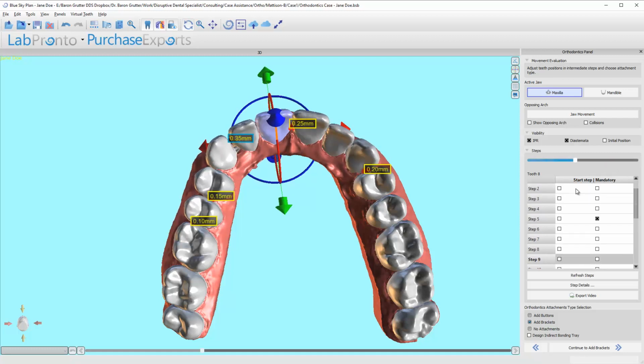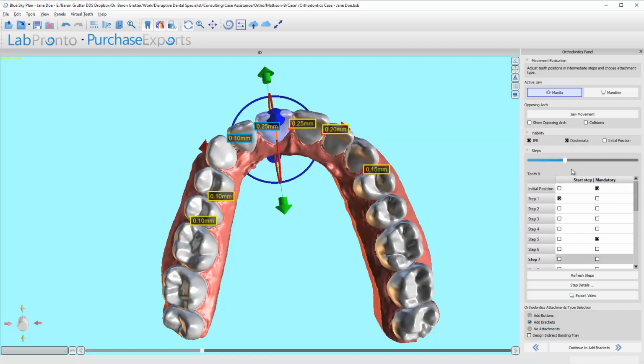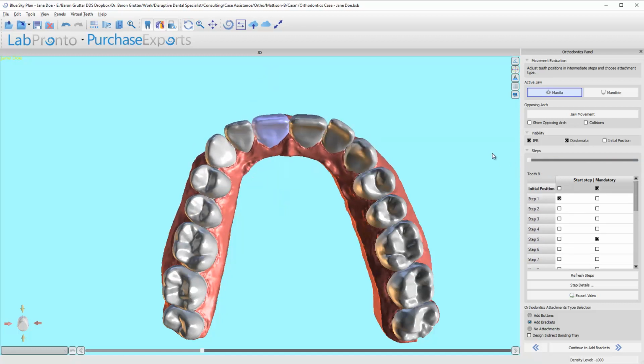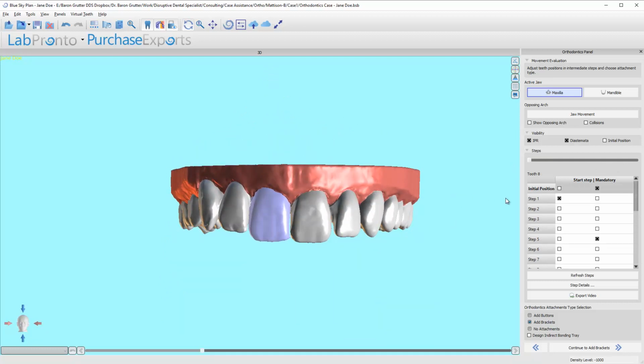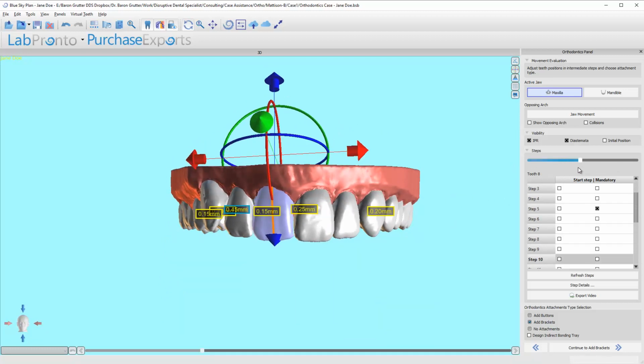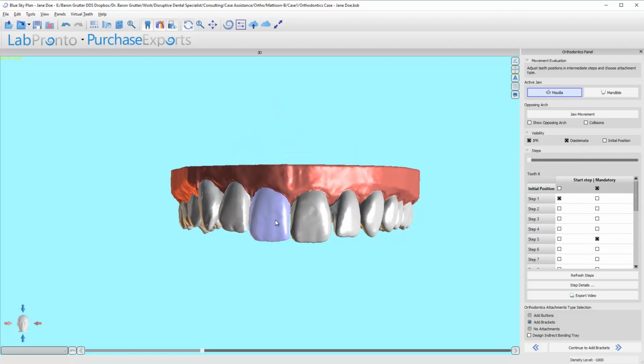Also, that canine is rubbing on the distal there. Now, again, I'm not actually that worried about it because I think it'll just deflect to the mesial, but I'm going to try to correct that just to show you how to correct it. That and the other central is the only other concern. So first thing I'm going to do, because the central is hitting this tooth prematurely and it's done moving so early, all I'm going to do is just tell it, okay, hold up.